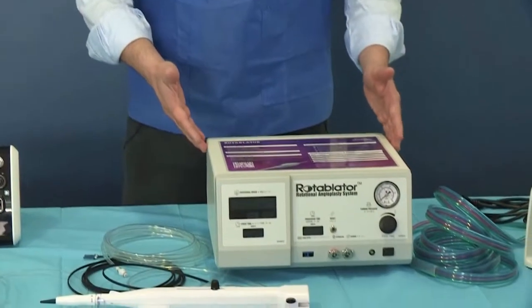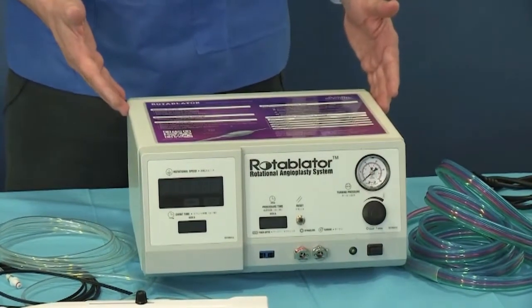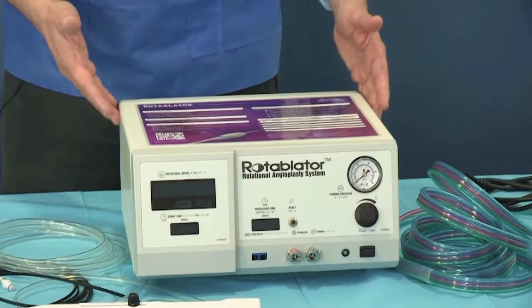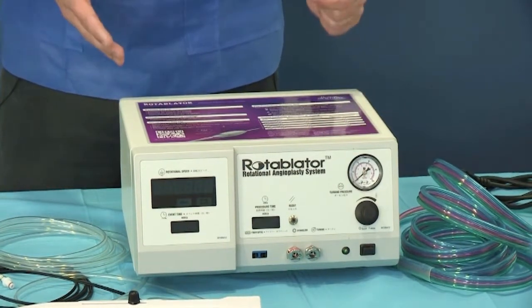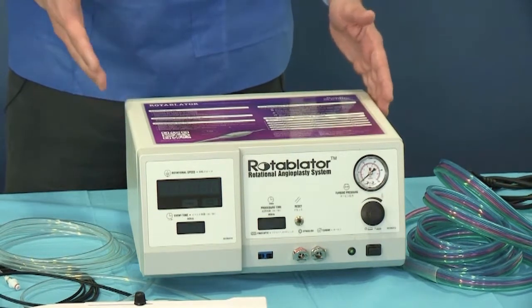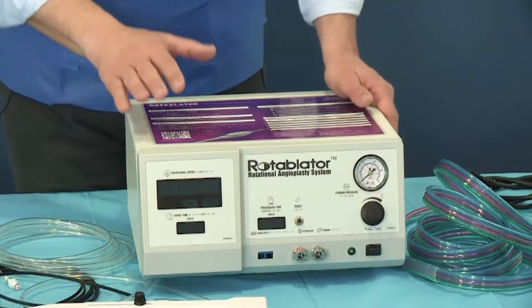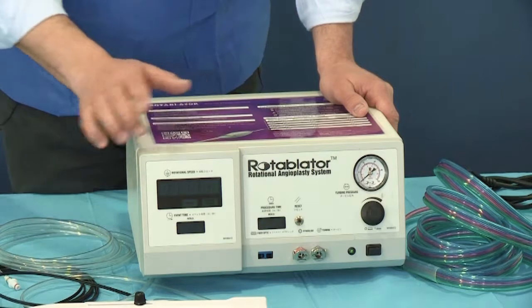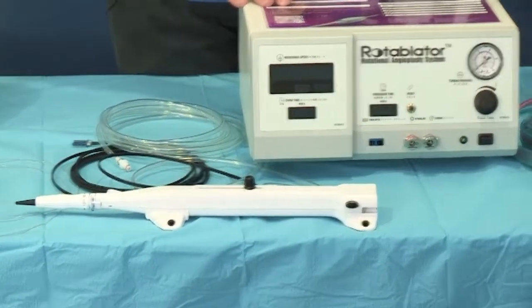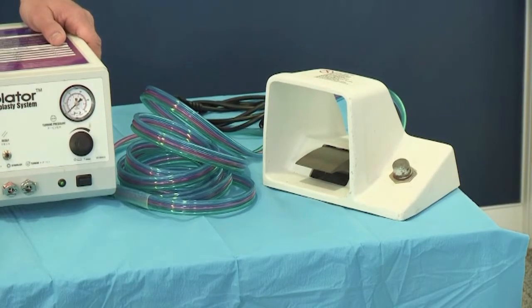This is a device that you might already be familiar with, and it is in fact the currently available rotablator system, the so-called legacy. Let me just remind you what the key features of the rotablator system are before moving to the new iteration of this device. So the rotablator system is composed of the console, the advancer, and the pedal. These are the three main parts of this device.